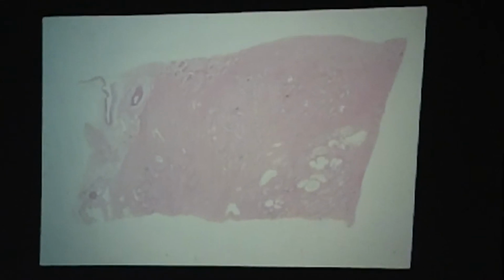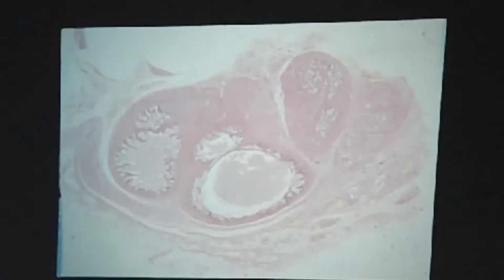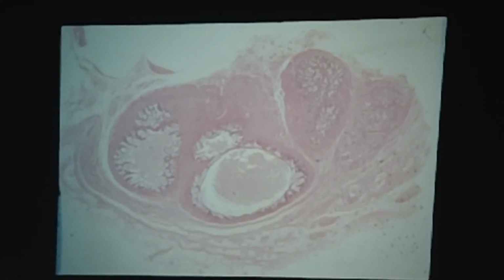If we look at the prostate, as has been mentioned today in lecture, your first impression is big fibromuscular stroma with lots of little glands. Remember, there are 30 to 50 of these tubulo-alveolar glands. So that, at a low power look, is a lot different than this profile right here. All right? The thing that's nice about the prostate, and unfortunately I don't have a great shot of it, although we don't need it now.